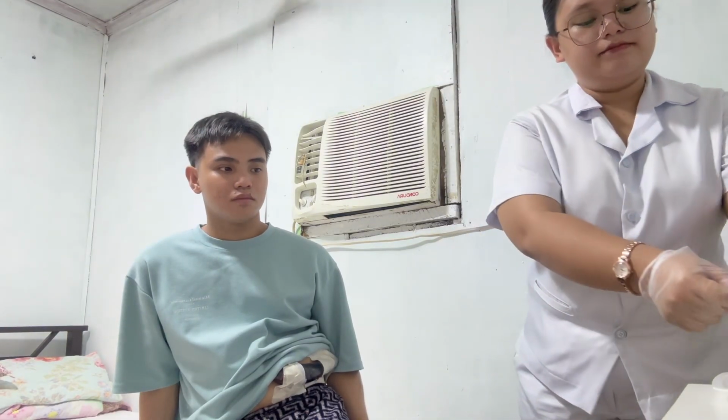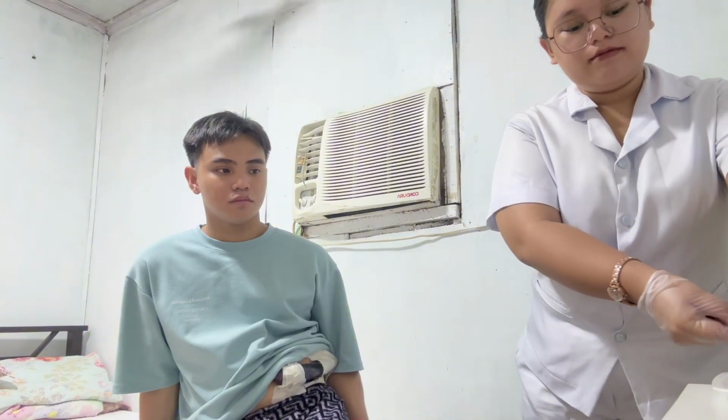We're going to remove the needle cap while waiting for the antiseptic to dry. We're going to pull the cap straight off to avoid contaminating the needle with the edge of the cap. It is also to maintain sterility of the needle and prevent contamination. Now, I will be injecting the medication to ensure a proper administration of the prescribed dose.